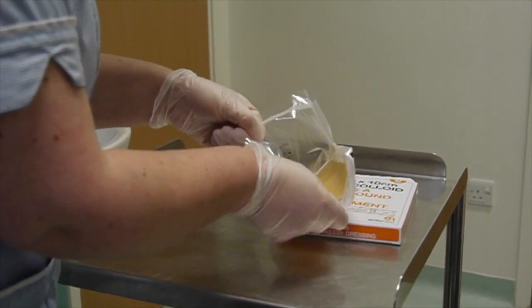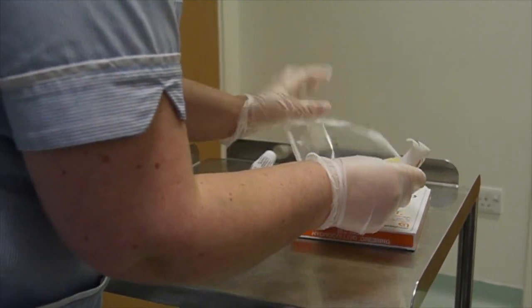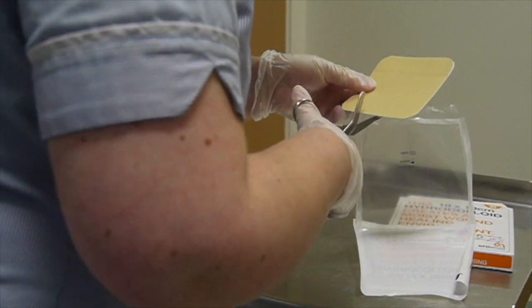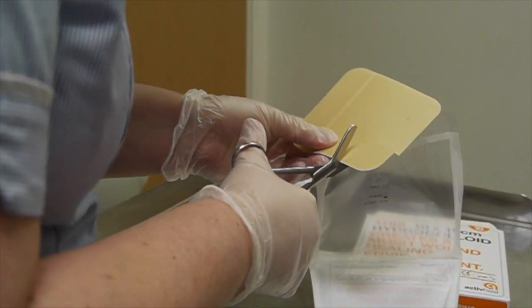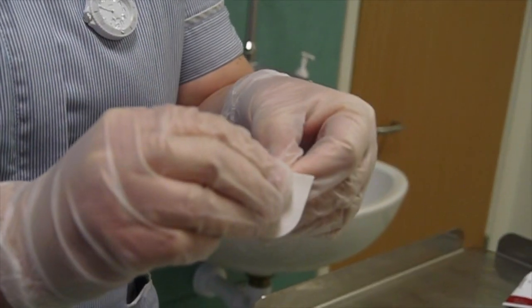The dressing packet is opened and using a pair of scissors a piece of hydrocolloid dressing is cut so that it will cover the small patch of eczema and also overlap it by about half a centimeter all the way around. If this isn't done then the hydrocolloid obviously won't stick to the ointment because there's not enough skin for it to stick onto.